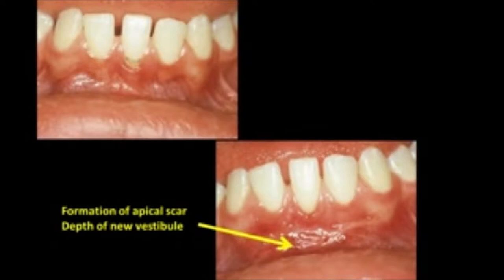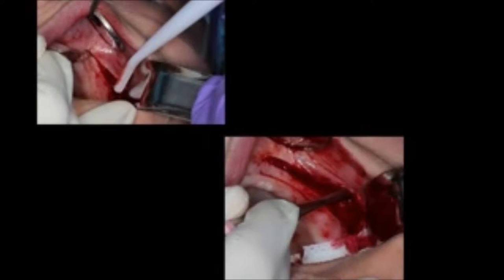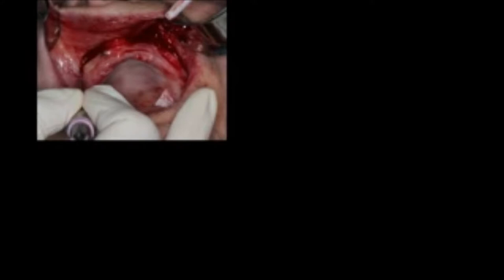The formation of the apical scar will define the depth of the new vestibule. The split-thickness incision is made at the mucogingival junction, and once you go 5 to 6 millimeters apical to that, you use the Bard-Parker to cut through the periosteum exposing bone. Then take a periosteal elevator to elevate the tissue, exposing a band of bone, which on final healing will form the white scar — this will be the depth of the new vestibule. The surgery is basically complete here.